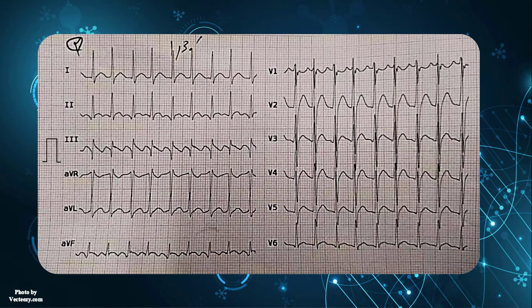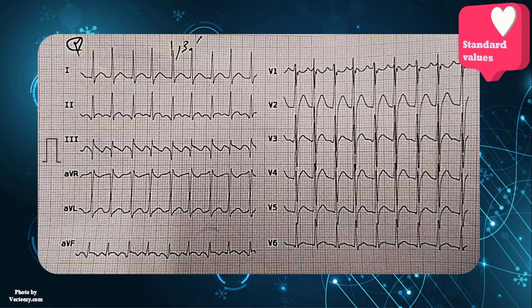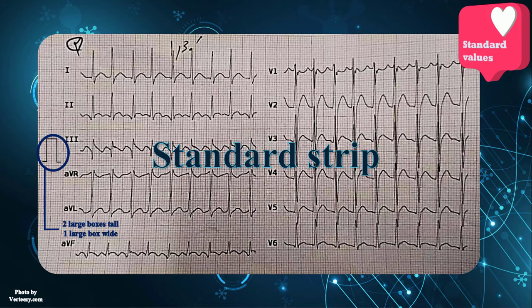To interpret every electrocardiogram properly, use the 10-step approach. First of all, start with standard values. In this strip, the calibration marker is one large box wide and two large boxes high. Thereby, this is a standardized 12-lead electrocardiogram.